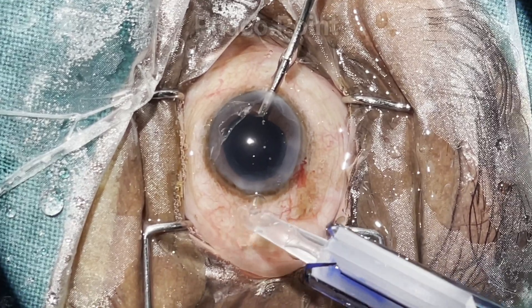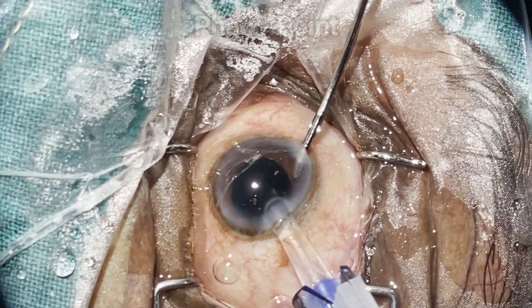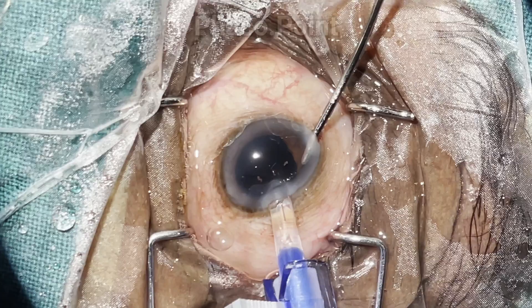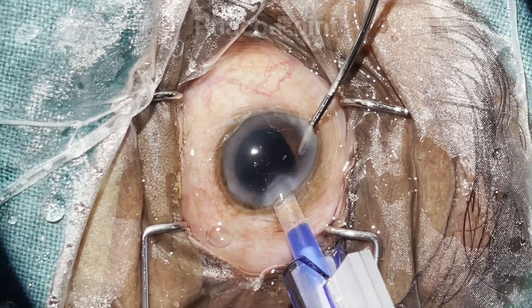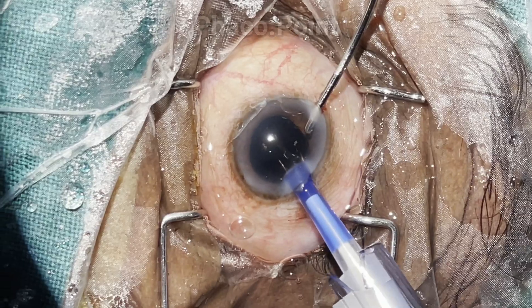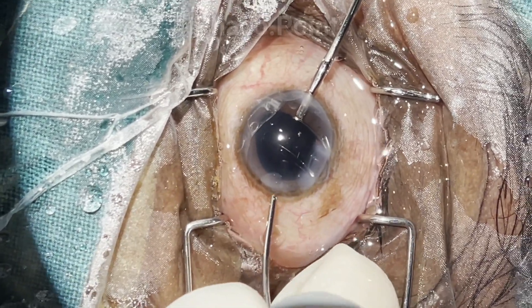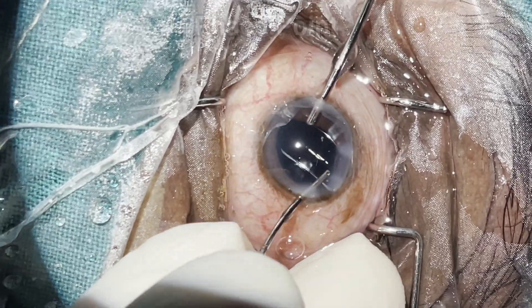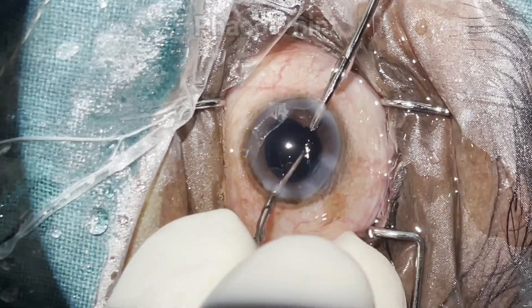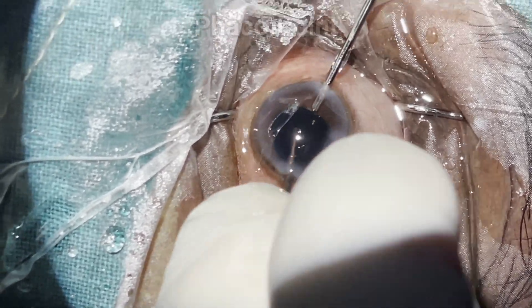The IOL is brought up to the tip outside the eye. The trailing haptic and part of the optic are in the anterior chamber. We can then use the aspiration cannula to slip the trailing haptic into the capsular bag, and it is rotated into a horizontal position. Finally, that very miniscule amount of viscoelastic that went in along with the trailing haptic is removed.